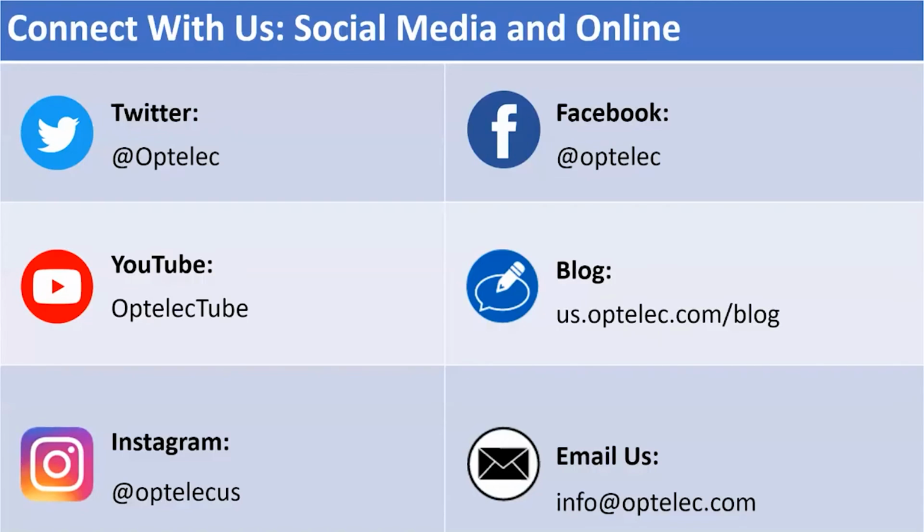And I would say, Optelec as a brand for Vispero, and the products it's developed, this is really a showcase product for us in terms of the use cases and the flexibility. But it's not alone in some of the releases that Optelec has made recently. They've started to change the approach, using today's technology to maximize the flexibility, portability and use cases for what traditionally have been very static devices, back 20 years ago when desktop magnification was widely used.